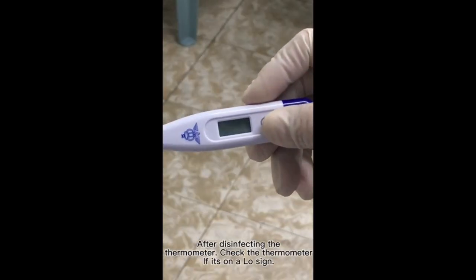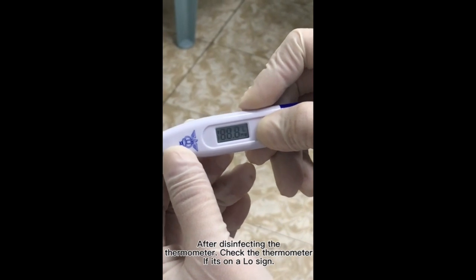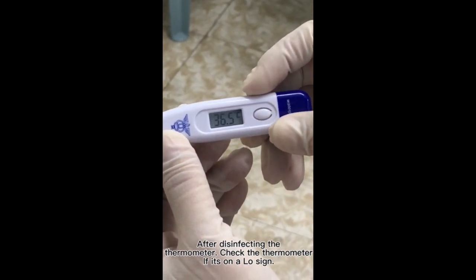After disinfecting the thermometer, check the thermometer to see if it's showing the LO sign. This will indicate that it is ready.